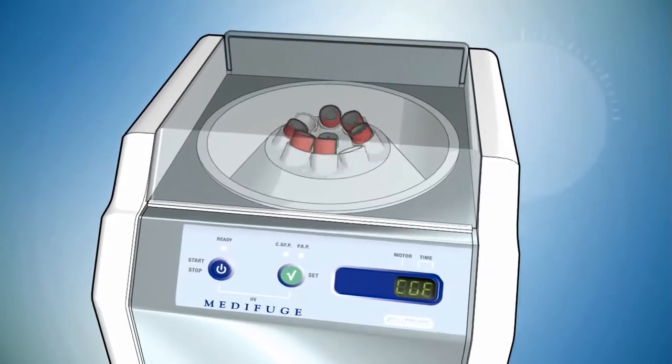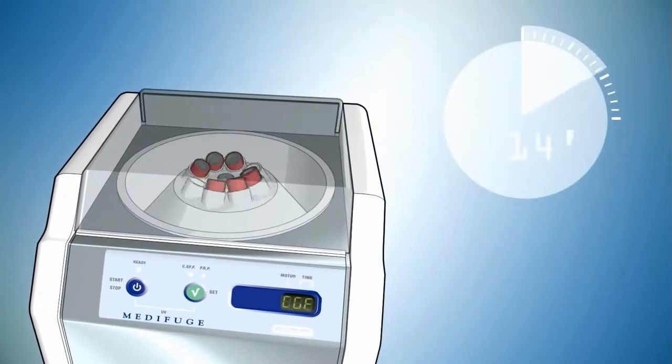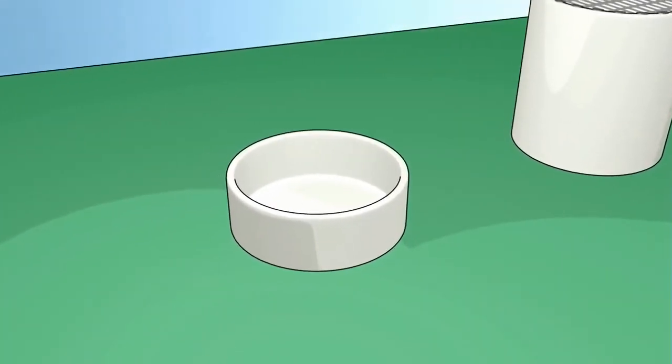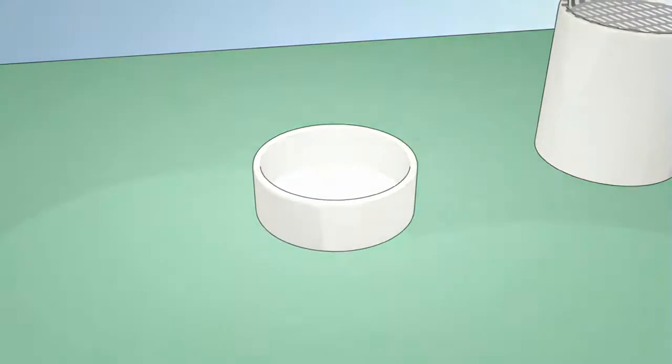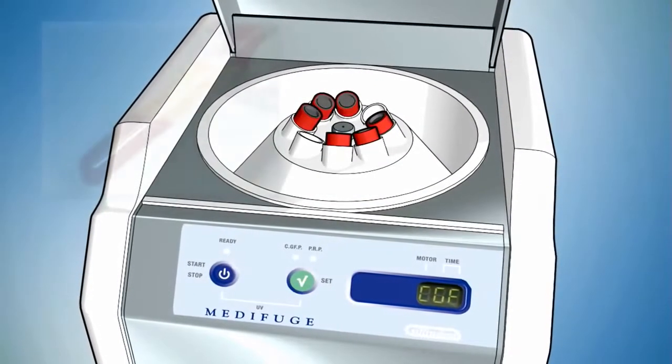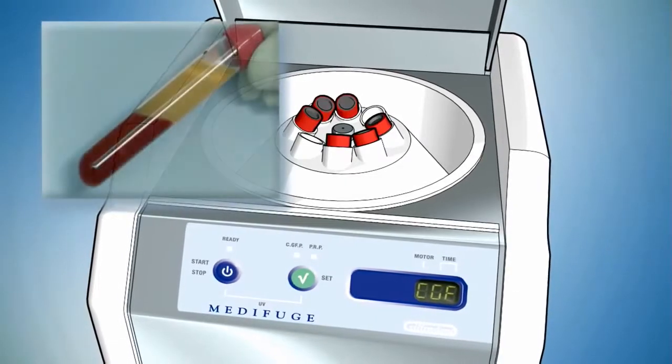The separation takes about 14 minutes. During this time, prepare the sterile table with the necessary instruments and containers into which you will put the CGF. After the separation process, in each tube there will be three distinct phases.